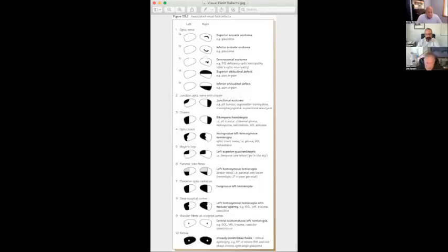The one that you just said is very important, because if we think about it, we're looking straight ahead with one eye open, we have a much wider visual field temporally than we do nasally. So we may have a temporal defect that's visible on one side that's just not represented in the other eye, because there's just not enough room to get that visual field. So again, we have to be open-minded that we're not always looking at glaucoma, we're not always looking at optic neuritis, but these visual field tests are one tool, and a very important tool in our toolbox, to help hone in on exactly what the problem is.